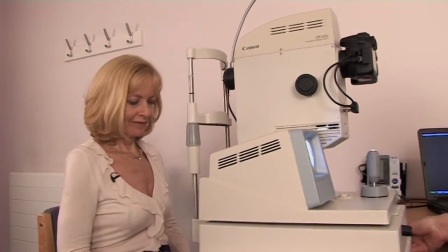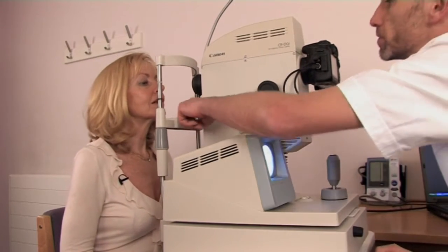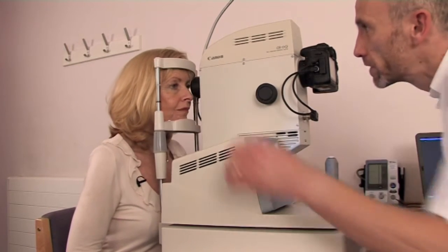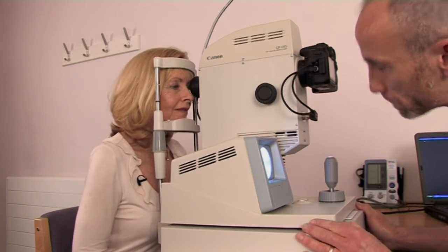Let me just wheel the camera up nice and close to you. All I need you to do is lean forward and put your chin on the rest, and just bring your head forward so that your head's touching the bar at the top, nice and tight. How does that feel? Is that comfortable? It's fine.